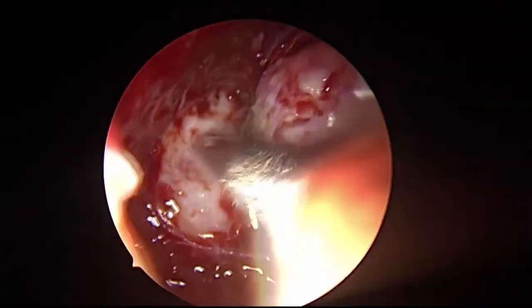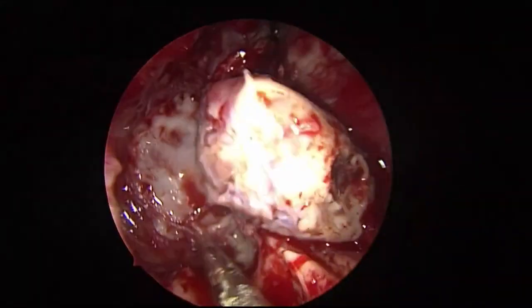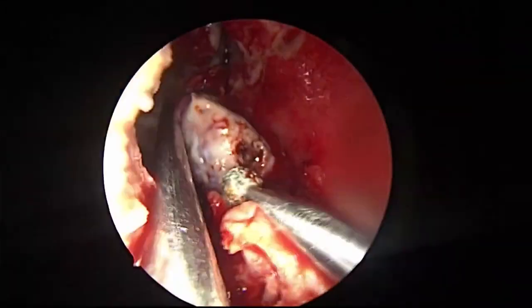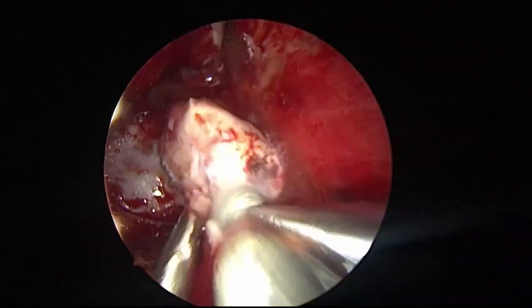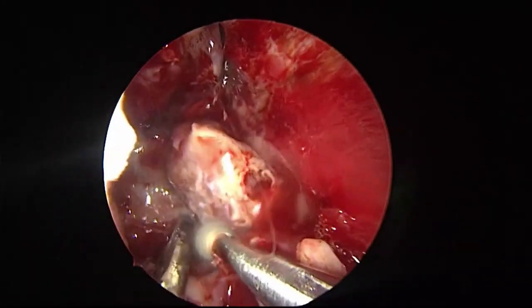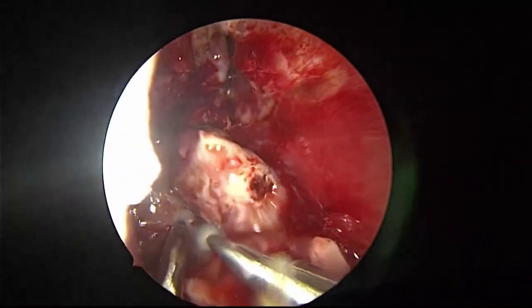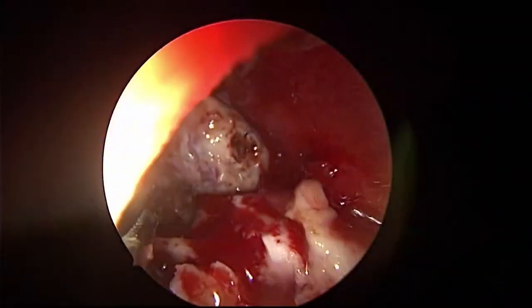See now the exposure. Much better. Yes, sir. My 90% of the time will be invested in exposure, exposure, and exposure. Needless to say. This projection I am flushing with the floor, so it doesn't stop my instrument. Otherwise, that limits your instrumentation, debrider.